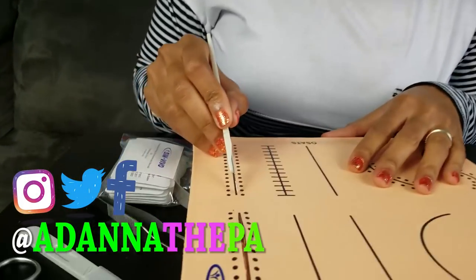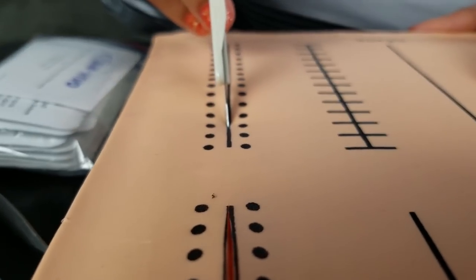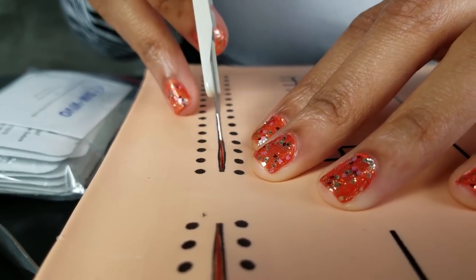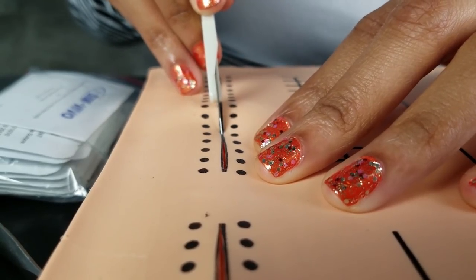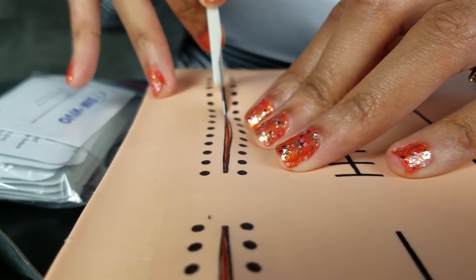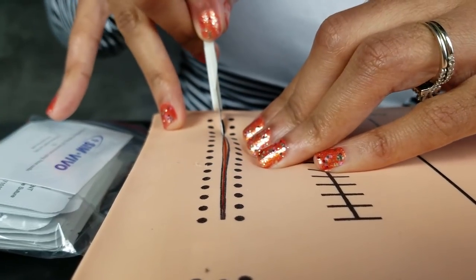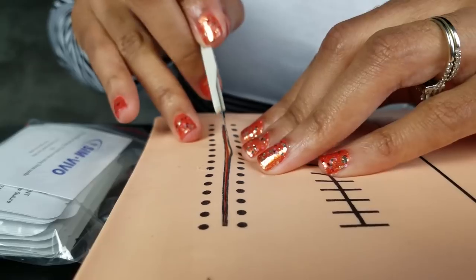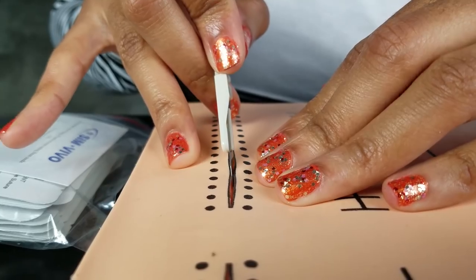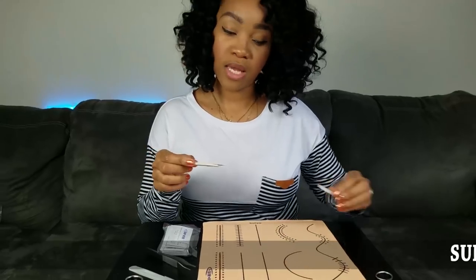This is what I'm gonna use for my simple interrupted stitch. I've only done this one time before. So I have to go a little bit harder, I guess. Oh, there we go. And you guys, this is very, very sharp, so please be careful if you do get your own. Be very careful with this. And I'm gonna go a little bit deeper. There we go. All right, so I've made my cut. I used the 15 blade for that one.